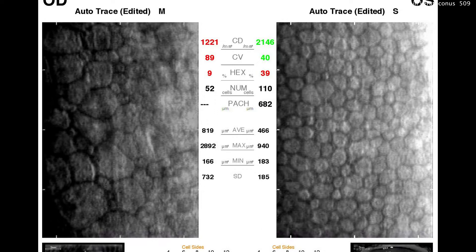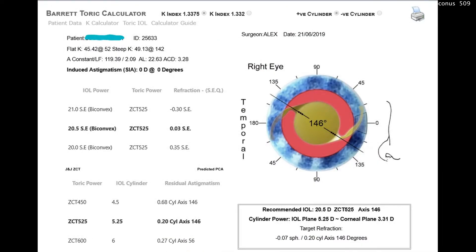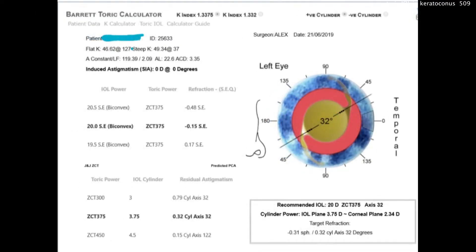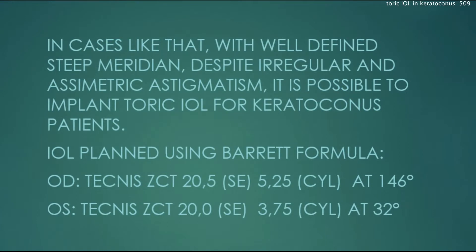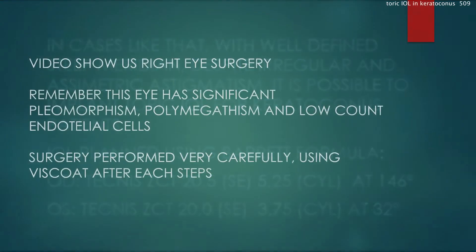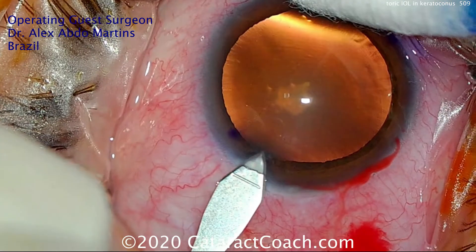Here's the lens calculation. This is looking at the endothelial cell count. And here's the Toric calculator for each eye — again, very consistent readings, which is helpful. The surgical plan shows a different Toric IOL on each eye, with a little bit of asymmetry in the amount of astigmatism.